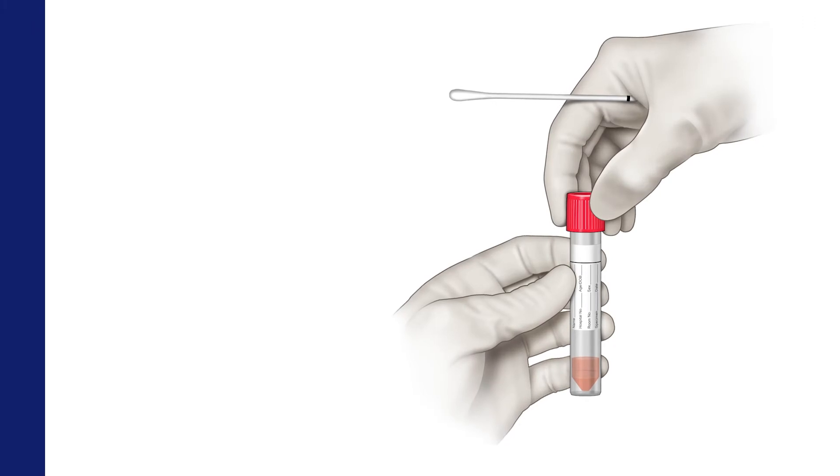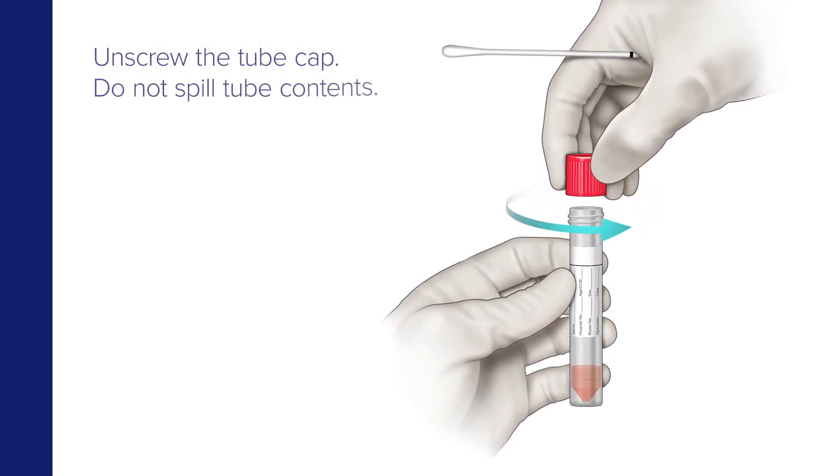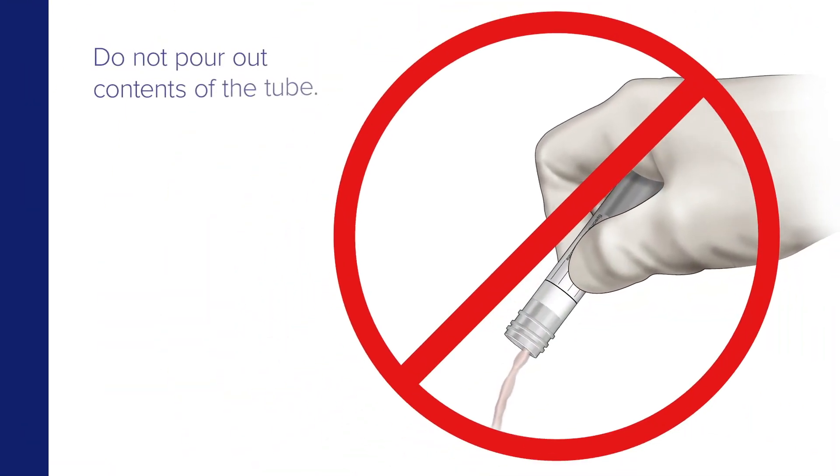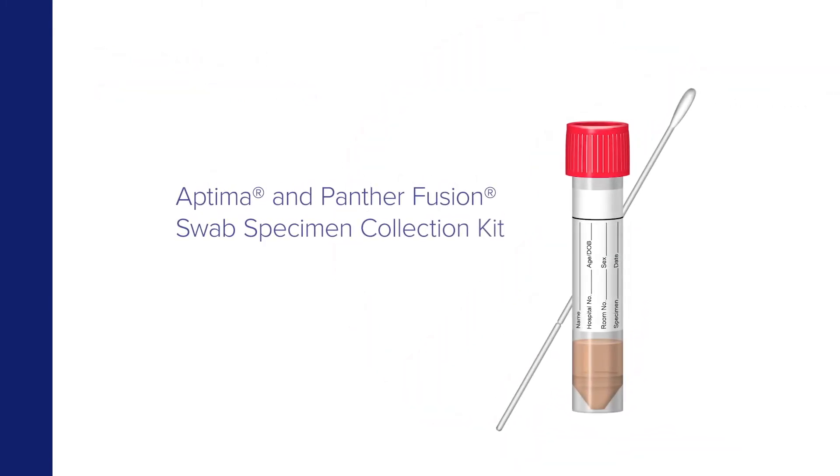While holding the swab in hand, unscrew the cap on the transport tube. Do not spill or pour out the tube's contents. If the tube contents are spilled, discard and replace it with a new swab specimen collection kit.